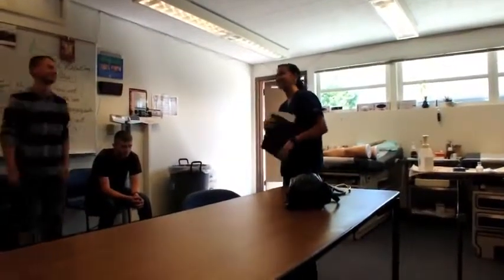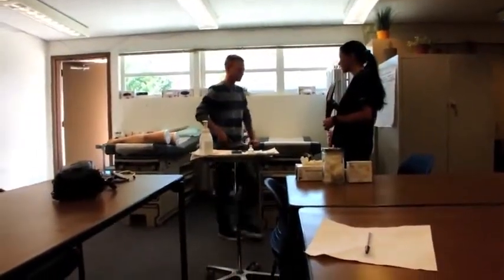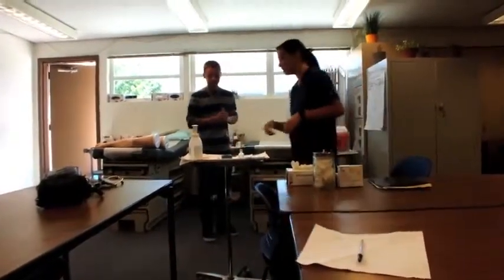All right, first I'm going to call back my patient. Devin? All right, we're going to go back here. All right, can I get your name and date of birth? My name is Devin Milligan and I was born April 4th, 1997. Okay. So today I'm going to be performing a blood glucose test.